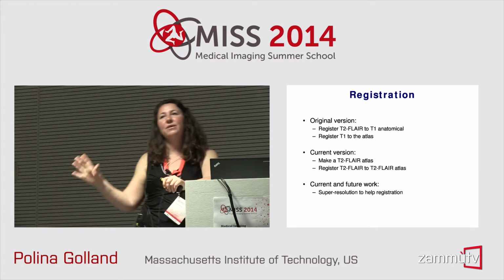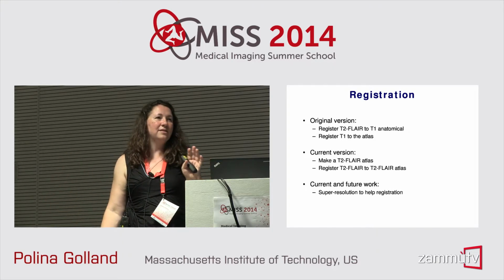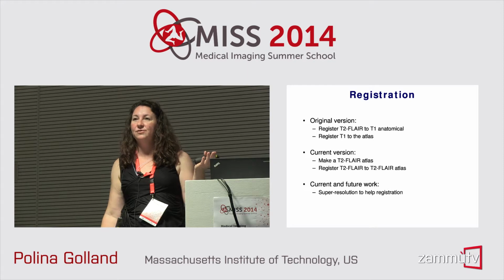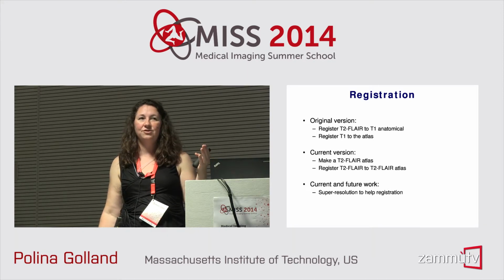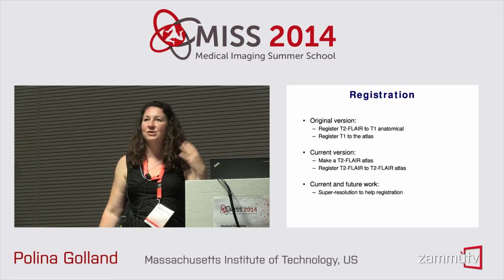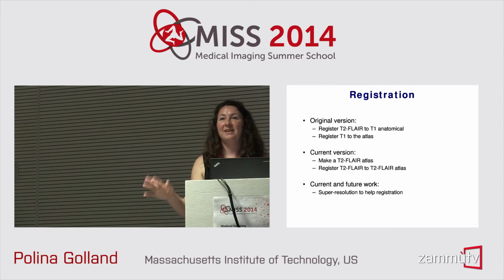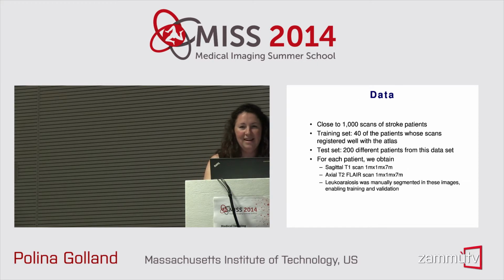Now we're working on new ways to do registration. I should also say that we're using the ANTs package from UPenn to do all of this registration. It took us a few months to actually find a good set of parameters for these clinical images, but it's a great package. Anybody who doesn't want to spend years developing their own registration algorithm, I recommend using ANTs and spending months setting the parameters.